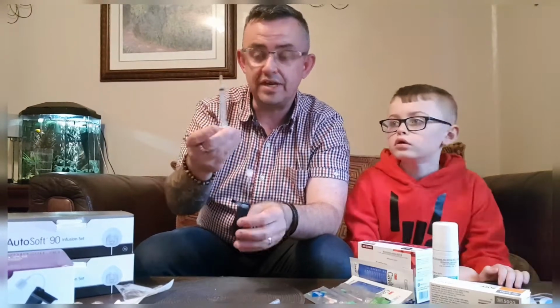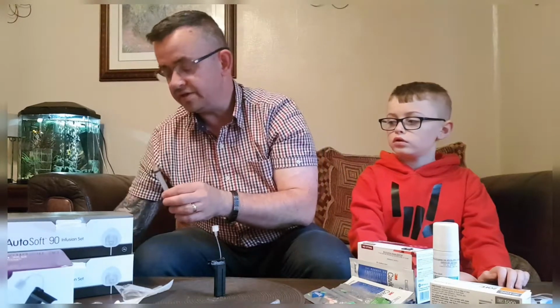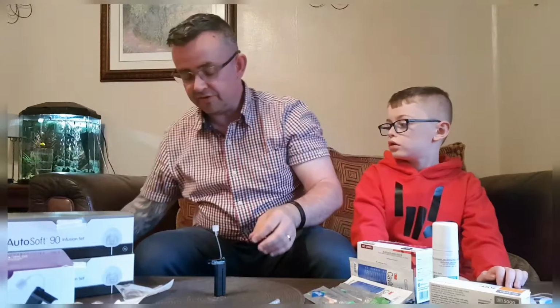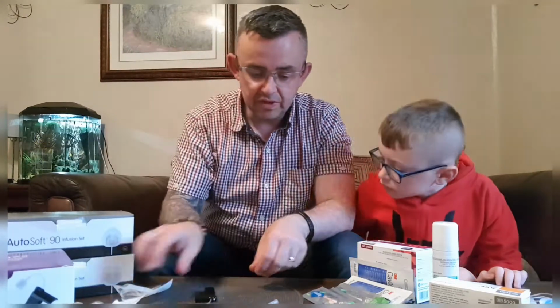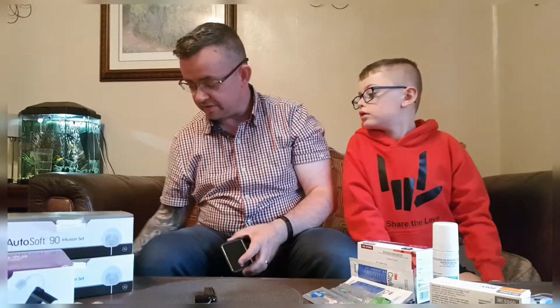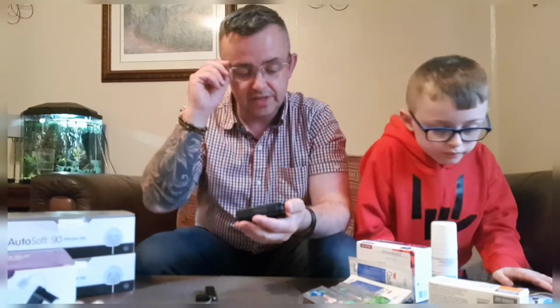Perfect. So that now goes straight into the sharps bin. And then we've got a filled cartridge. That's my sharps bin, where all the needles and horrible nasty things go. All the sharps.